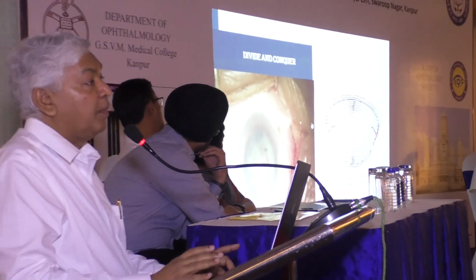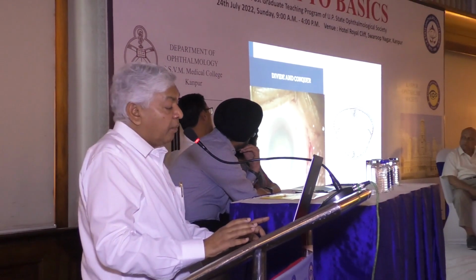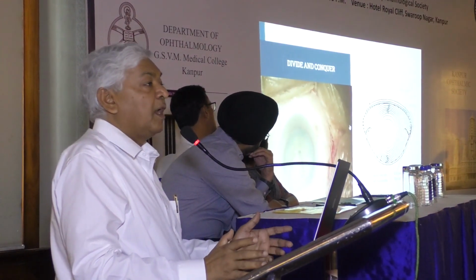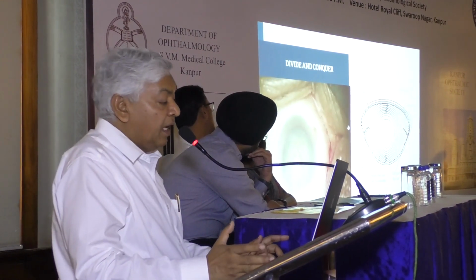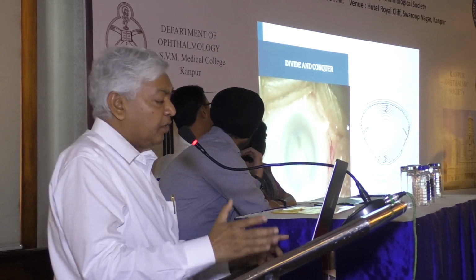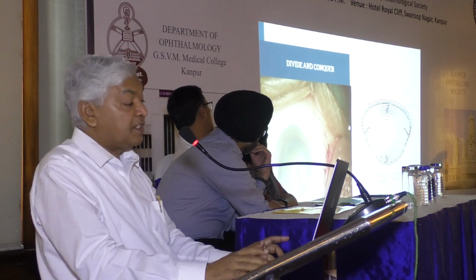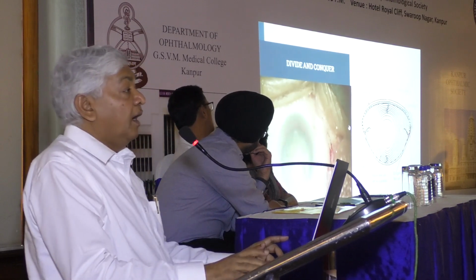So for beginners, you can very easily divide the nucleus into 4 quadrants. If you become expert, you can make even further smaller pieces. You can break it into different pieces and then hold it.